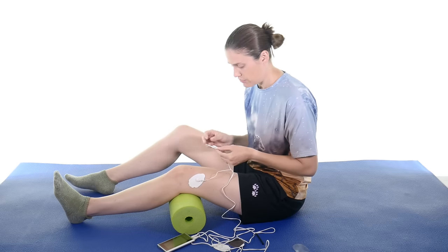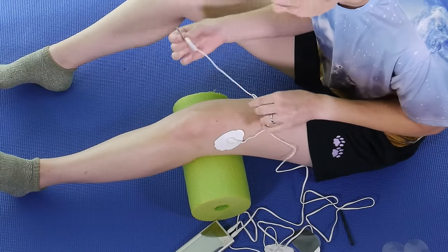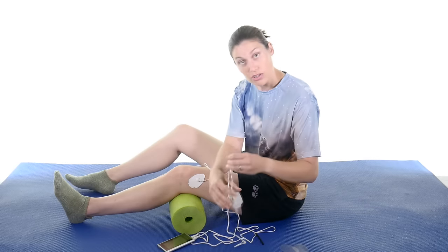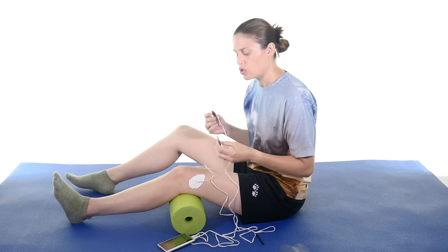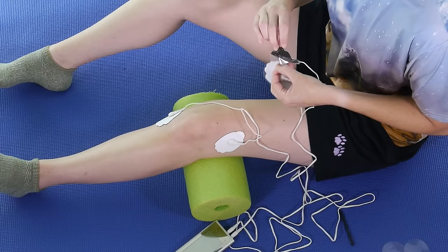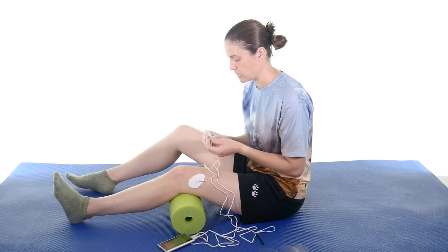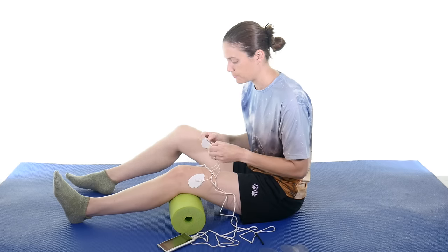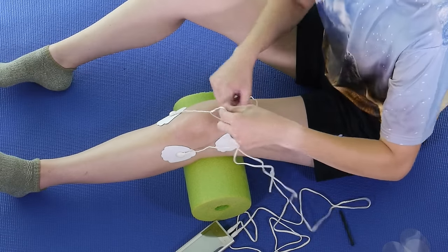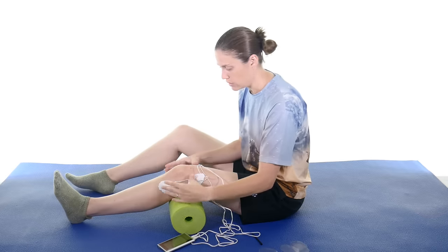It doesn't have to be in an exact spot for the TENS. Sometimes you might want to even move it around a little bit once it gets started, and that's fine. So I'm just going to cross it here and then take the other channel and cross it as well. You can see I haven't turned the unit on yet — I usually get everything set up before I turn it on. I get everything nice and set up first. As you can see, this channel is crossing and this channel is crossing — you want to make that X, and that's really important.